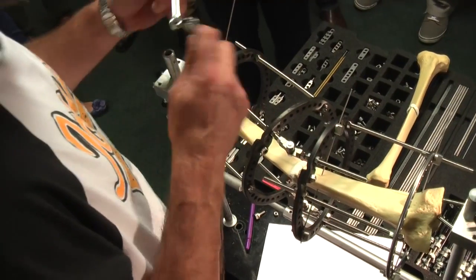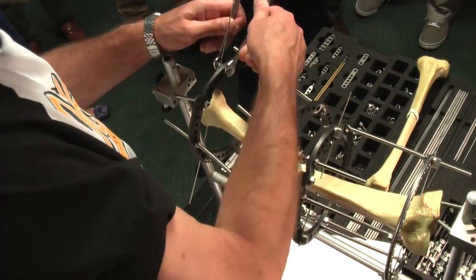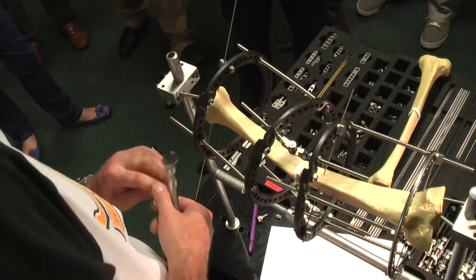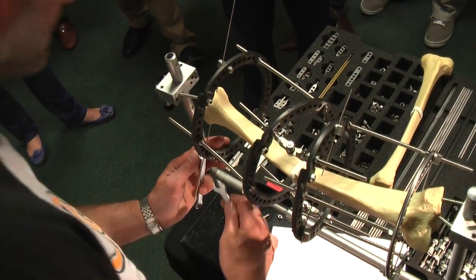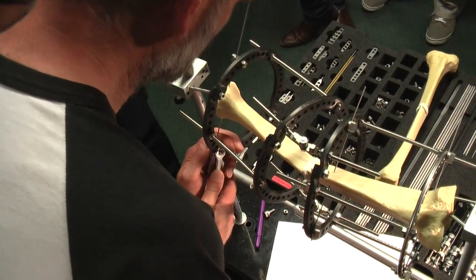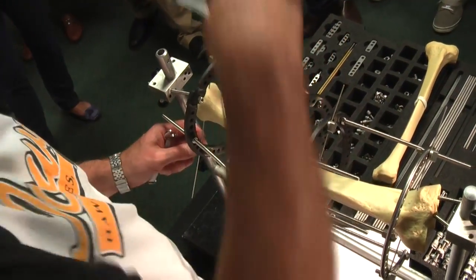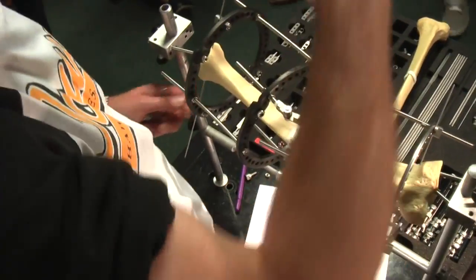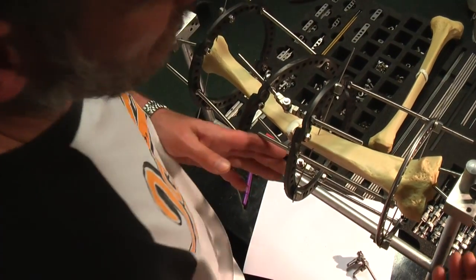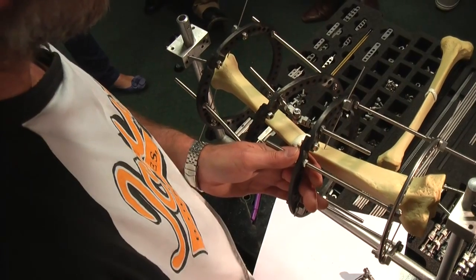And again, we're not going to tighten this wire up too much yet, just in case we need to move things. Just give it all a bit of a nip. Okay. So as I stand there now, that frame is bent 30 degrees as I look at it straight into there. Okay. And what we'll do is I'll just disconnect this and spin it round so you can see it.